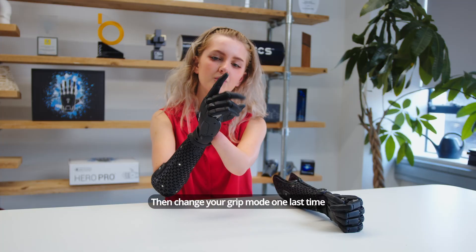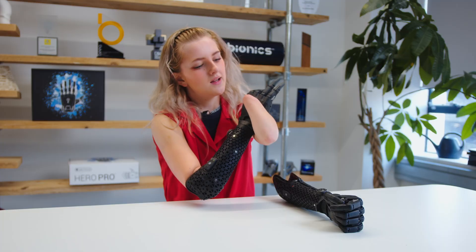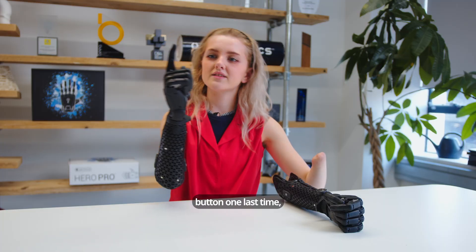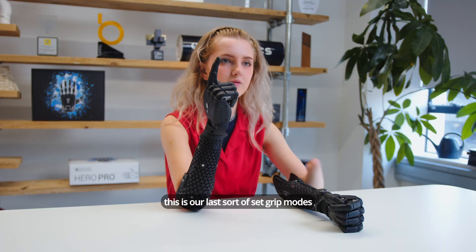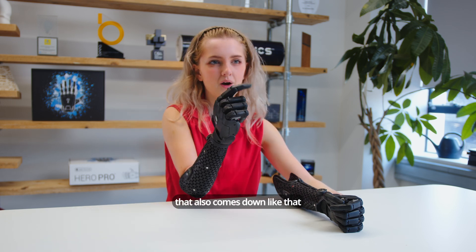Then change your grip mode one last time and we've got a two-finger pinch here as well. Next, if I press the button one last time, this is our last set of grip modes — you've got this point, like so, that also comes down like that.